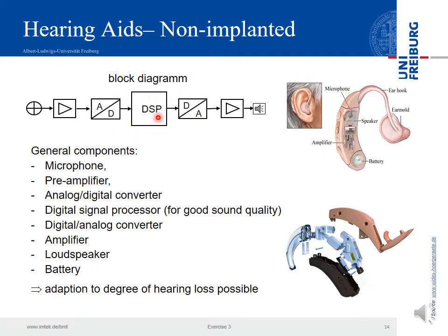And of course, this is not just a simple operational amplifier that amplifies everything, but has certain frequency bands, for example to suppress very low frequencies that can be caused by vibrations or movements, so suppression of movement artifacts. You should not have any feedback loops and should keep the distortions as low as possible.